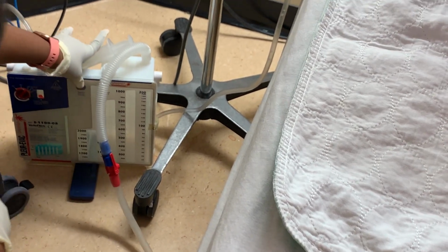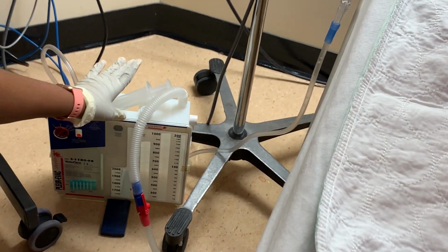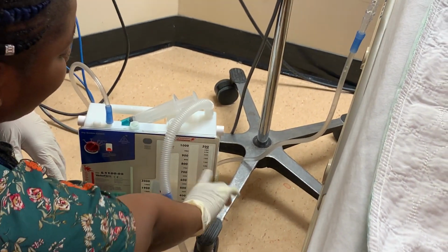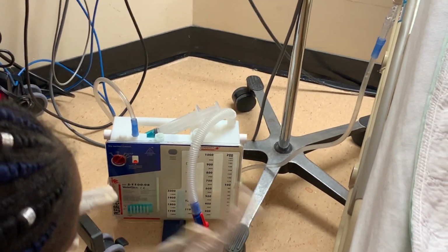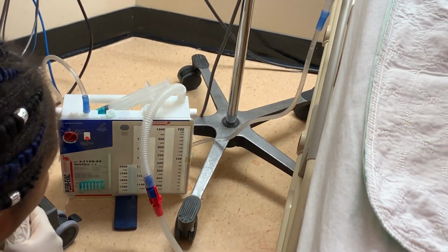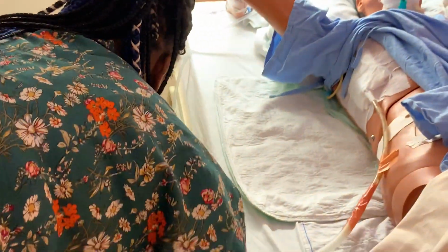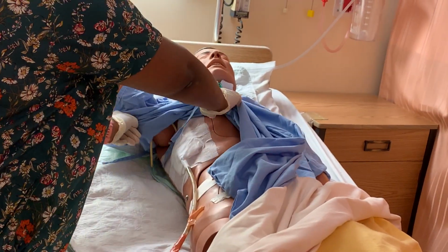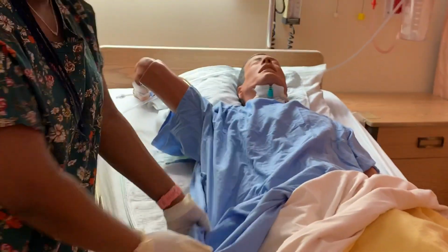So at the beginning of my shift I can mark where it's going, so at the end I can make sure there's no change in the drainage or nothing else going on. Okay. So I'm also going to get my tubing mat to go back up here. There's tension on the dressing here. And yeah, that's it. So now I'm going to do a dressing change.